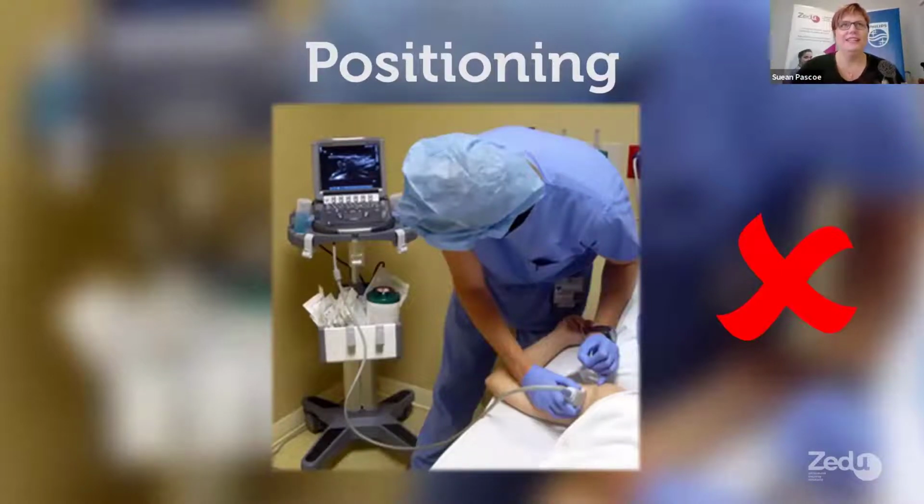Your machine is in front of you, so you want your knees and your eyes and your hips all pointing in the same direction. So in this instance, having the machine on the other side of the bed would increase the chances of success here. And this positioning, not only is it just awkward and not so ergonomic, but it has to be challenging spatially to figure out which side everything's coming from when everything's back to front.